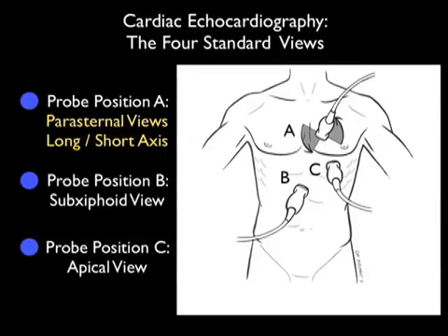wall motion abnormalities. So, in conclusion, the parasternal short axis view of the heart gives a great deal of information about the contractility of the left ventricle. This will allow you to identify patients who may have a cardiogenic cause for their presentation.